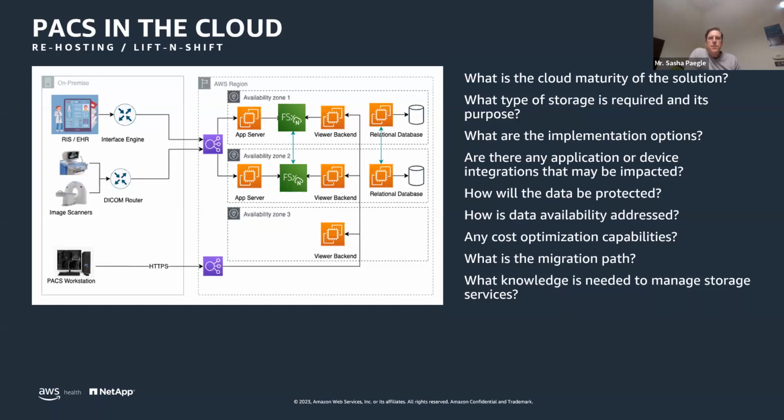And shifting into more of that cost optimization point of view, what if AHI Memorial didn't have a VNA? What if the PACS was the system of record for all images? For all different storage services, whether it's file or block or object, one of the areas you really want to dive into is the concept of tiering, and how images might be moved from high performance storage, that SSD or flash type of storage, into a more capacity tier, that warm or cold tier of storage. How is that actually done?